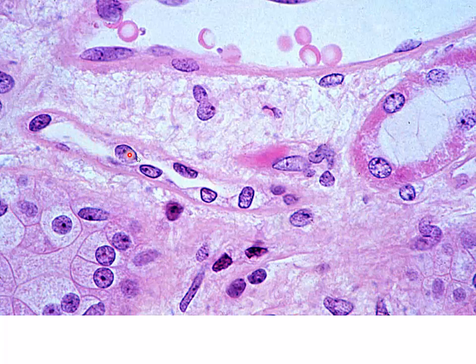This is part of our thin limb of the loop of Henle. So this is pretty easy to distinguish because of the absence of our red blood cells. And you see how tall these nuclei are? They're not nearly as flattened and tapered as our endothelial cells in our blood vessels. So that's another indication we're looking at portions of our thin limb of the loop of Henle.